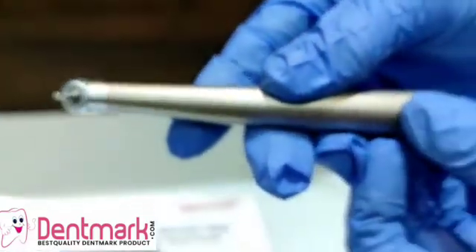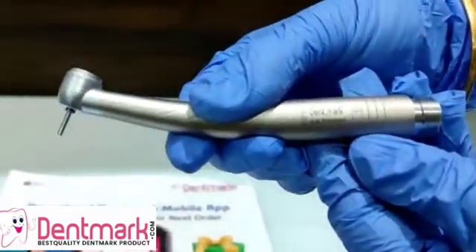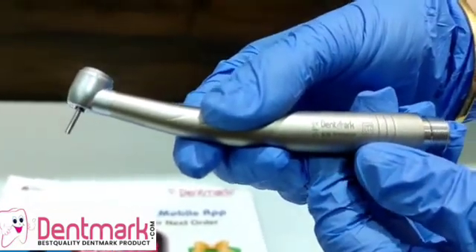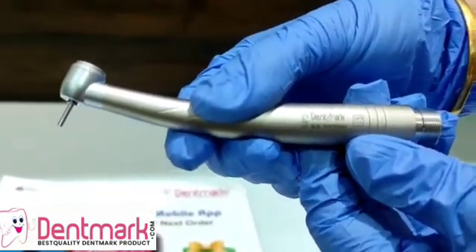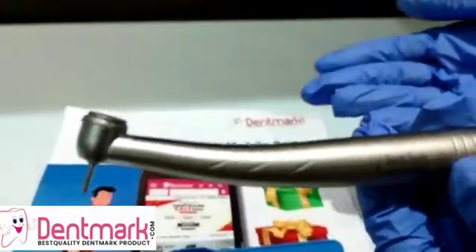Go ahead and buy this SP2 series high speed handpiece by Denmark at our site www.dentmark.com. You can even go in for our mobile application Dentmark for many other products.